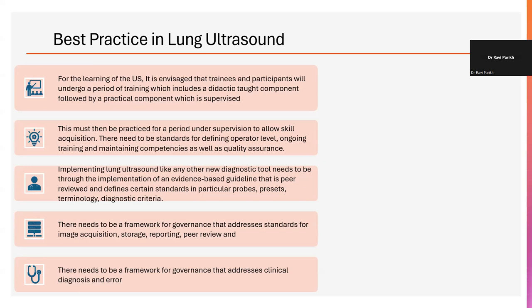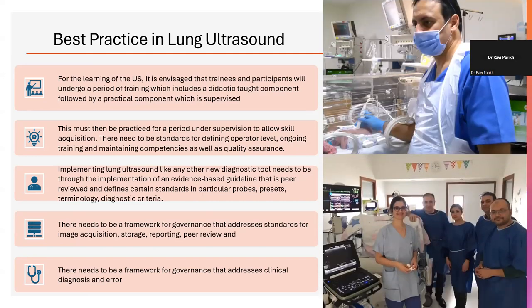The reason I'm covering this is if you start implementing lung ultrasound in your units helter-skelter, not taking your colleagues along with it, it just results in a lot of conflict and actually hinders the process of being able to implement lung ultrasound successfully alongside respiratory diagnostic tools that are already being used, in particular chest x-ray. I think what I'd say is that all of this needs a period of training.